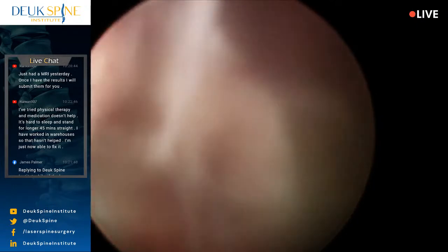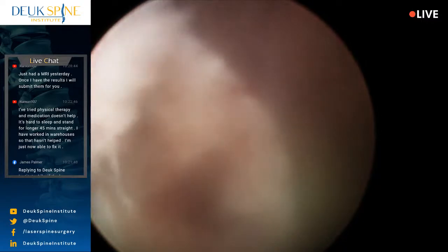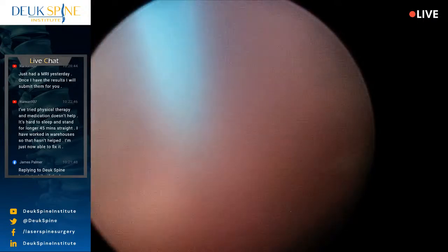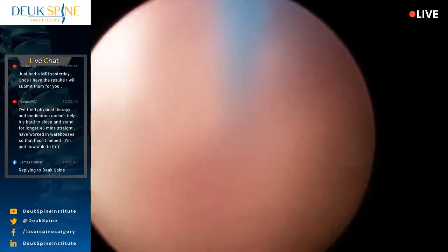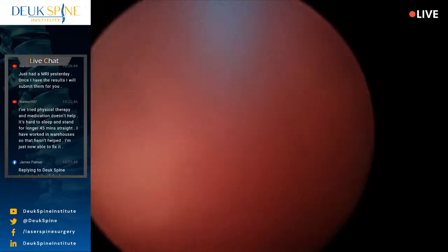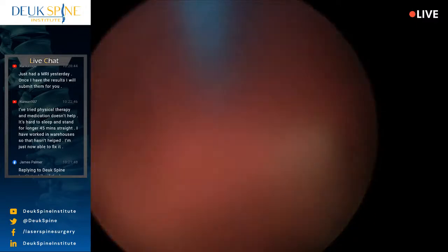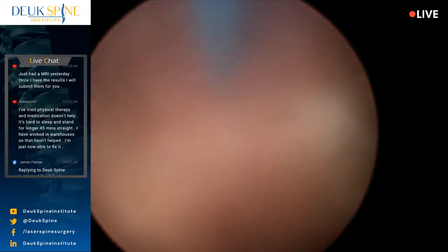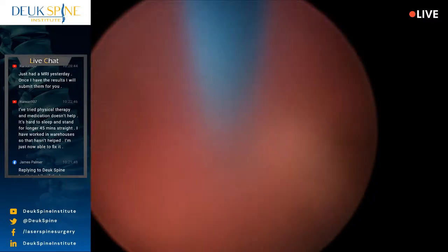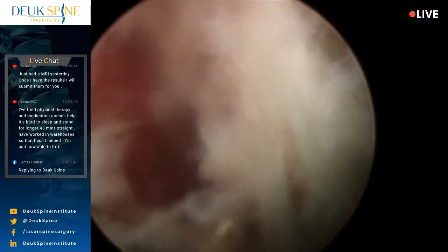Looks good. I want to get the back side. We're just about done with L5-S1. I'm very happy with the progress we're making, but I'm not happy with the redness of the fluid, which is really insubstantial bleeding, inconsequential, minor, nothing. We've probably lost maybe 20 drops of blood, maybe a milliliter so far, but certainly not more.